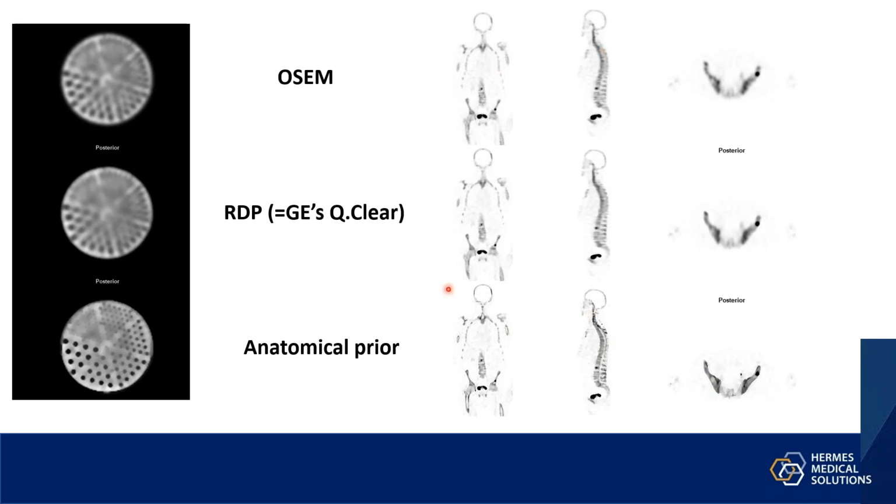But all these methods are available in the hybrid recon package. So if you have time, please check them out and see what you think.